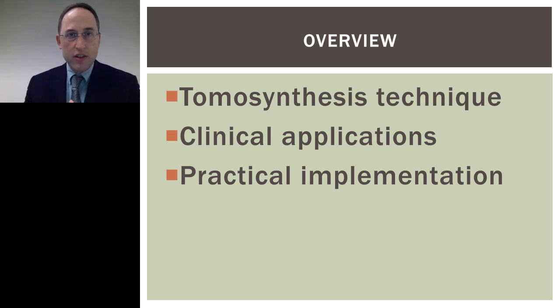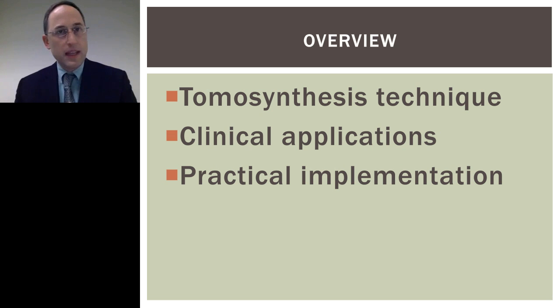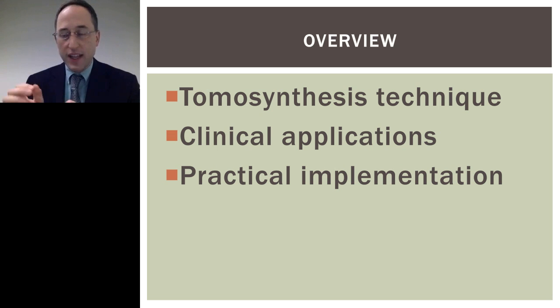Then I'm going to discuss the clinical applications, and that would be things like, is there any evidence out there that tells us how this modality performs? Maybe are there specific indications that have been investigated?